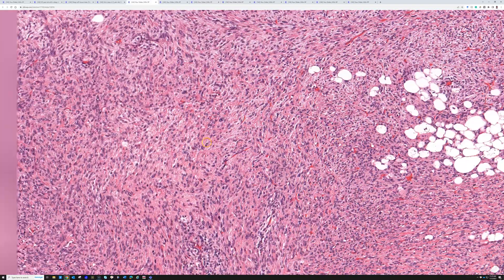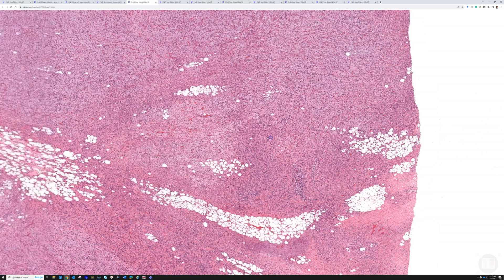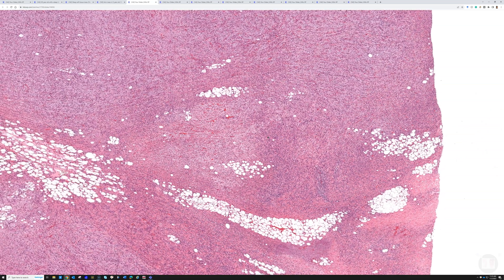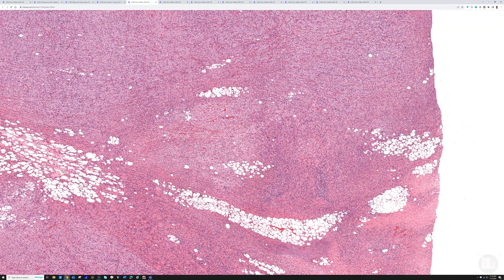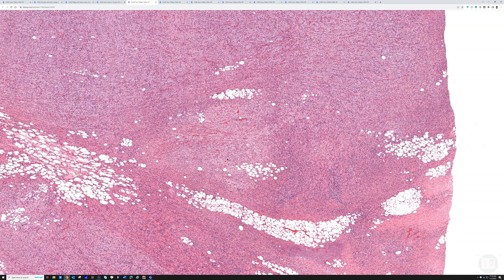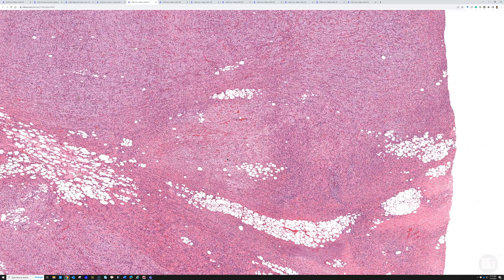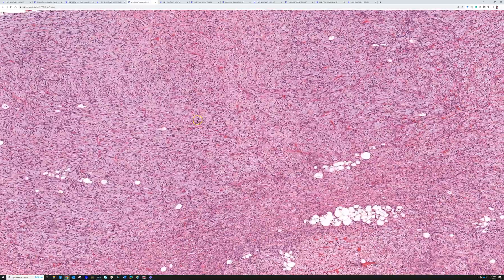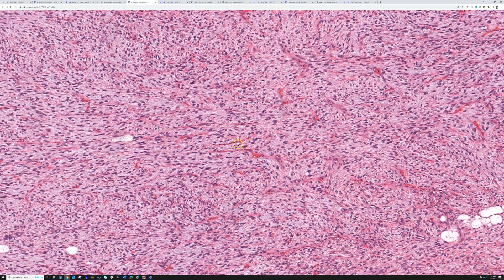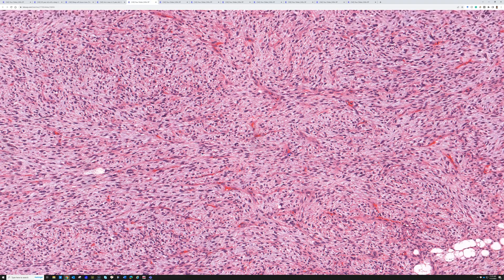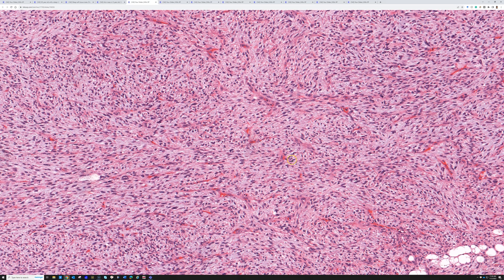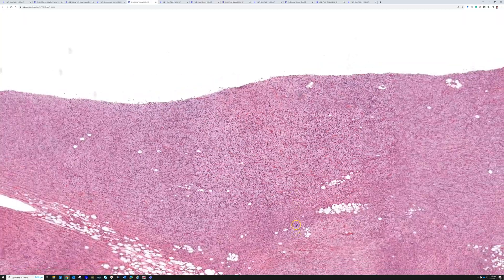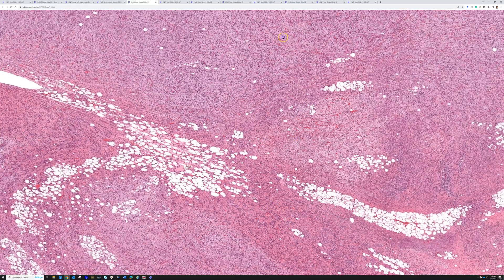I think it's important to study de-differentiated liposarcoma because they're relatively common among sarcomas, and they can have such dramatic differences in morphology from case to case and even within the same patient's tumor. In this case, we've got areas with elongated vessels and atypical cells and a myxoid background, resembling myxofibrosarcoma. We have areas with lipoblasts.